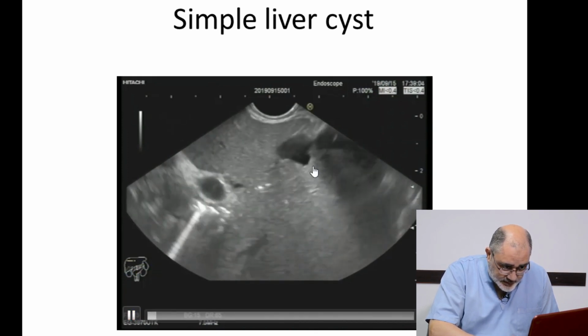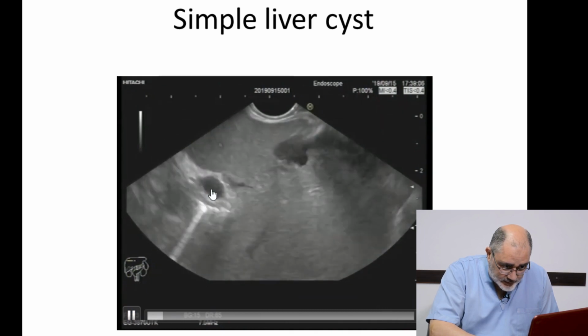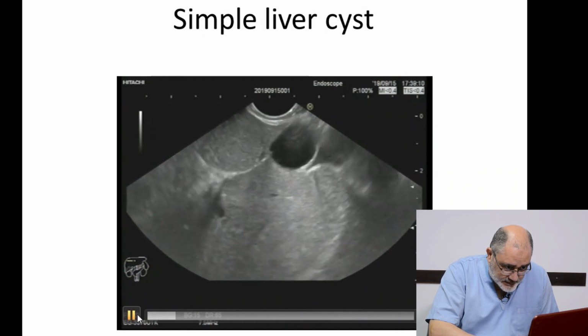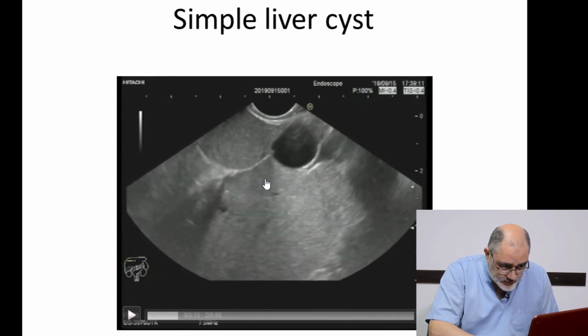Yes, this is the middle hepatic vein, and this is the left portal vein, and this is the IVC, and this is the very nicely seen ligamentum venosum. So this is the ligamentum venosum, going from the left portal vein to the IVC. And here this is the IVC and the insertion of the middle hepatic vein inside the IVC. So this is the ligamentum venosum, middle hepatic vein.